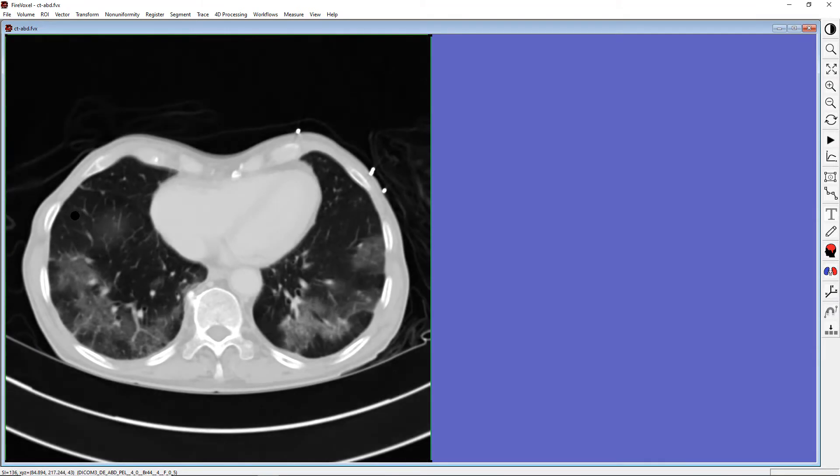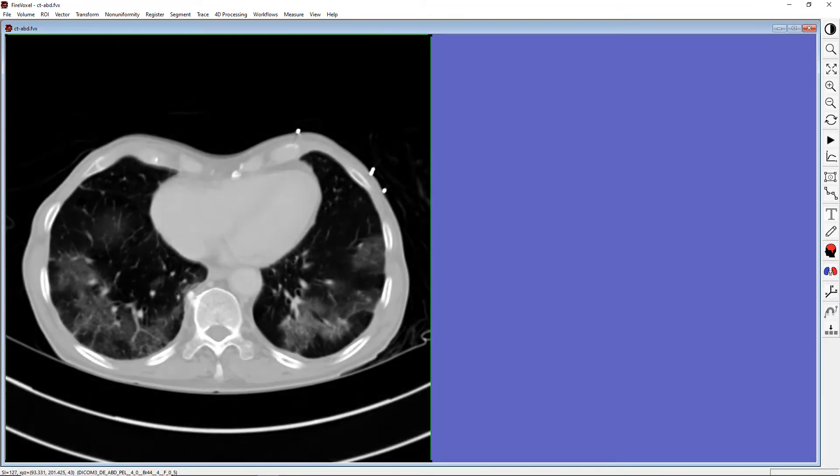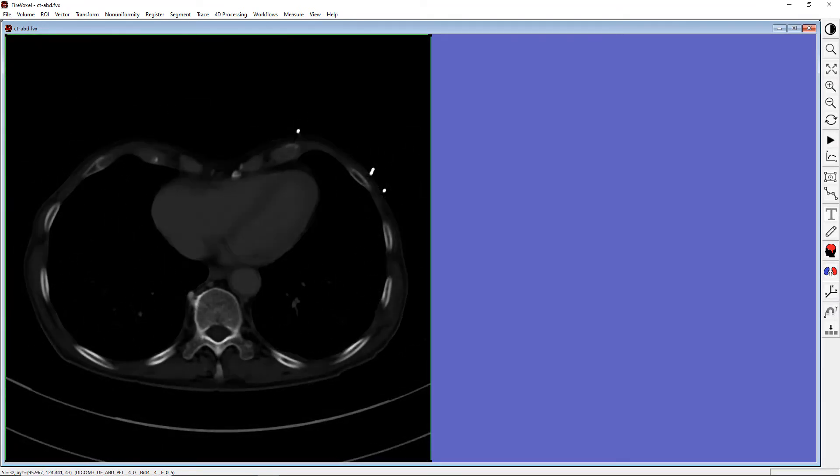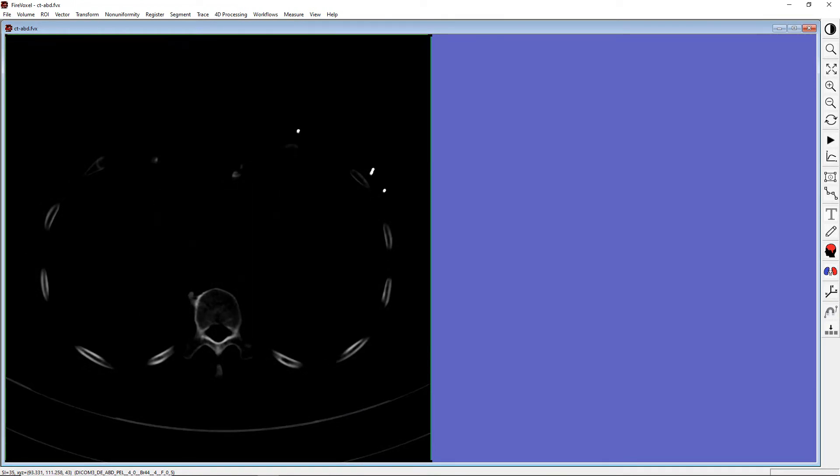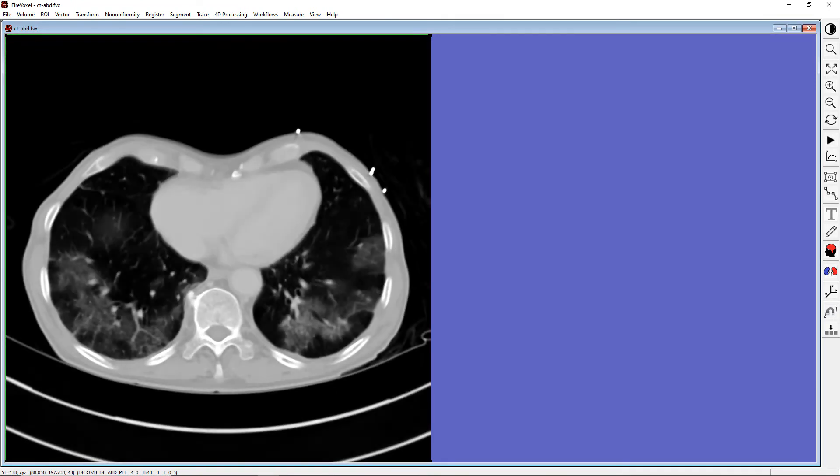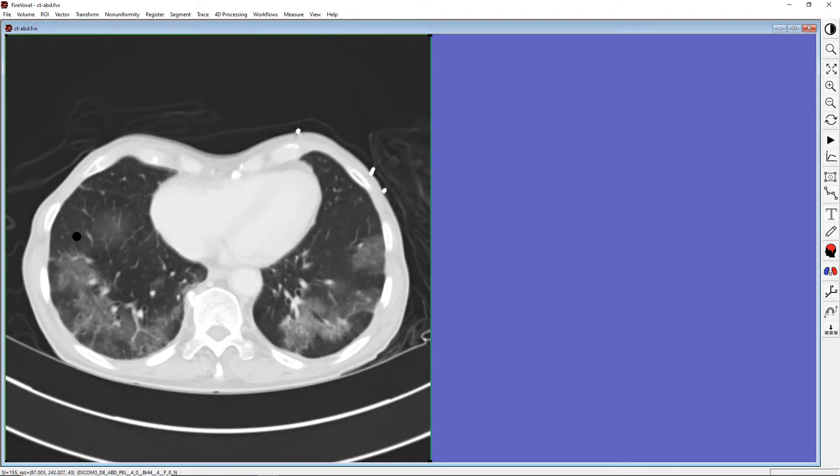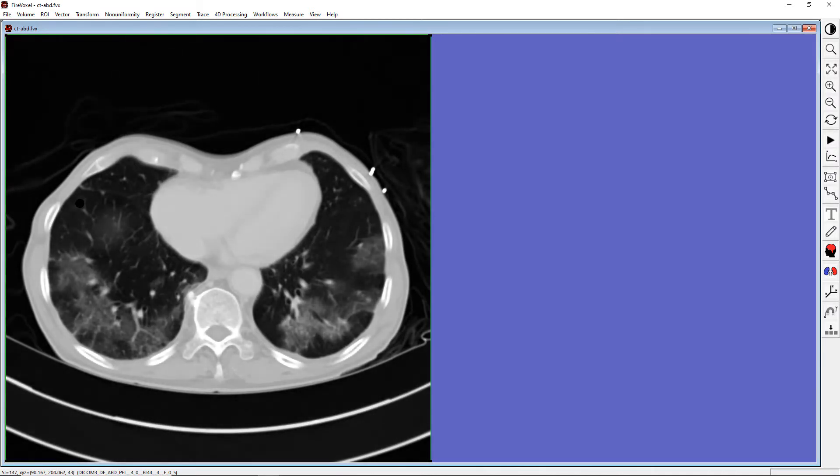To raise the window center, click and drag the mouse upwards. To lower the center, drag the mouse downwards. For the lungs, we need a wide window and a low level. For the bone, we also need a wider window, but a higher level.